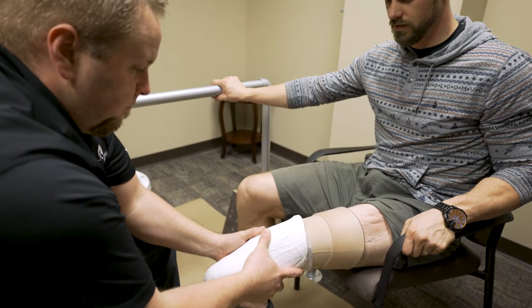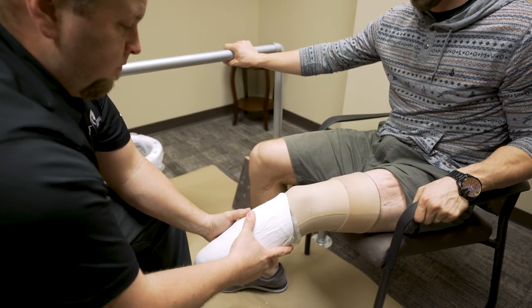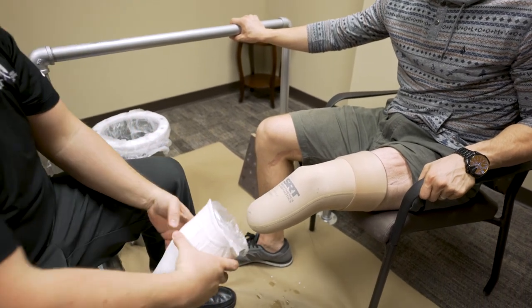The patient can now begin to lift up out of the tank. Take note that they will not be able to bend their knee at this time. Once the leg is completely out of the Symphony Aqua system, the patient may sit down and the cast is ready to be removed.